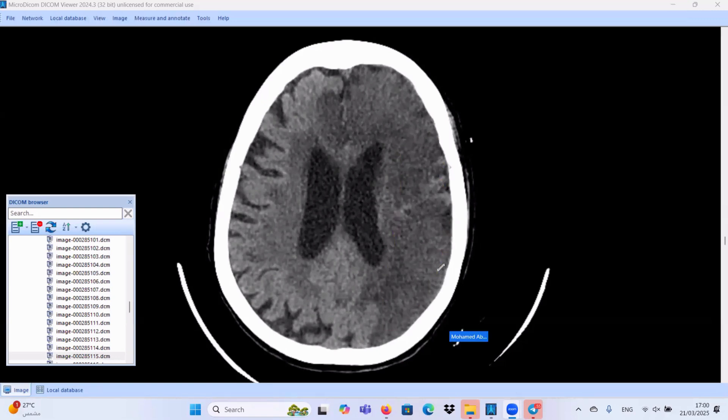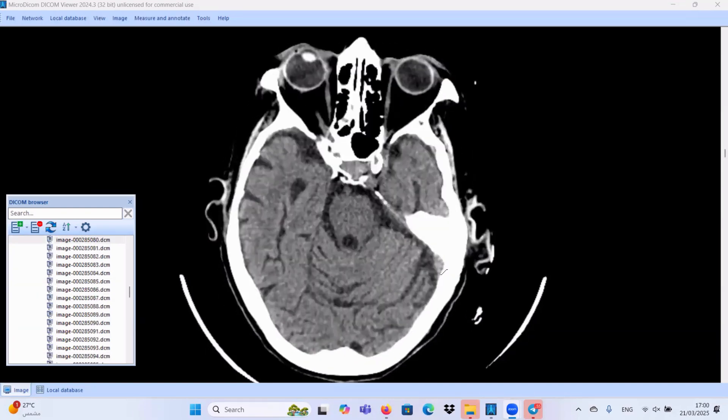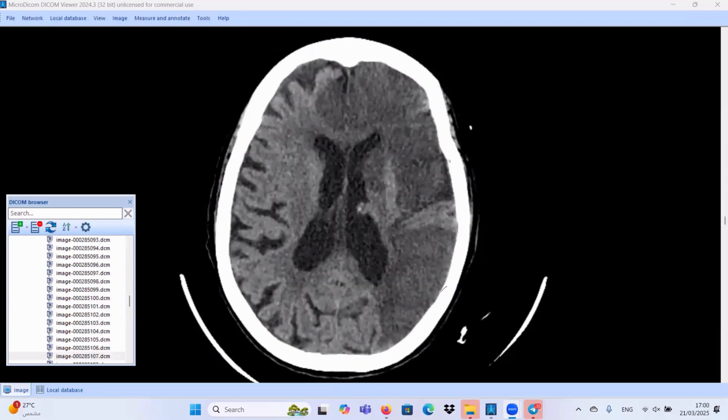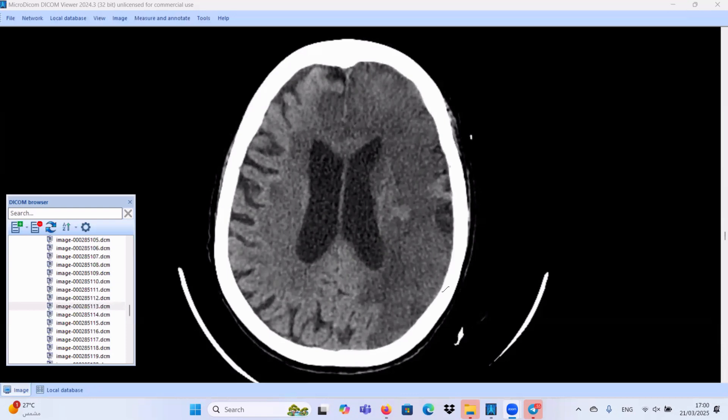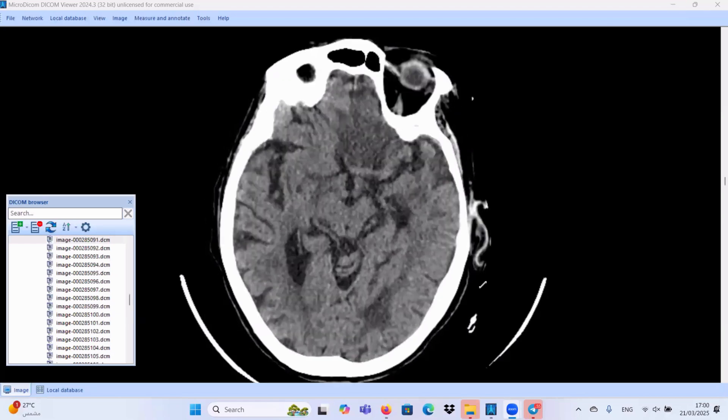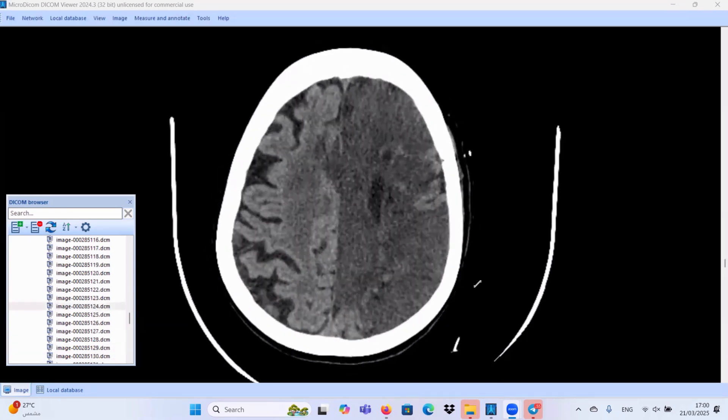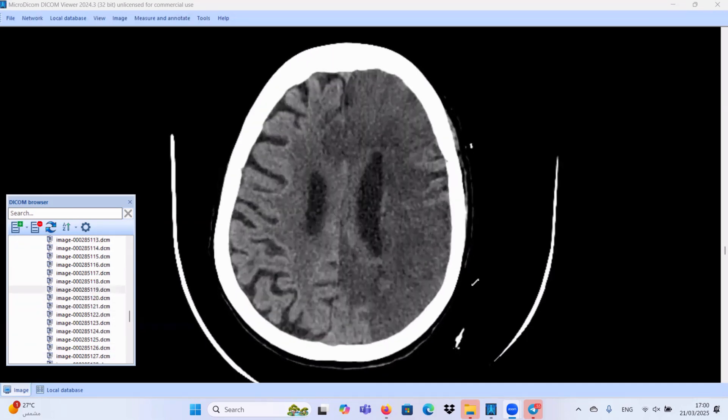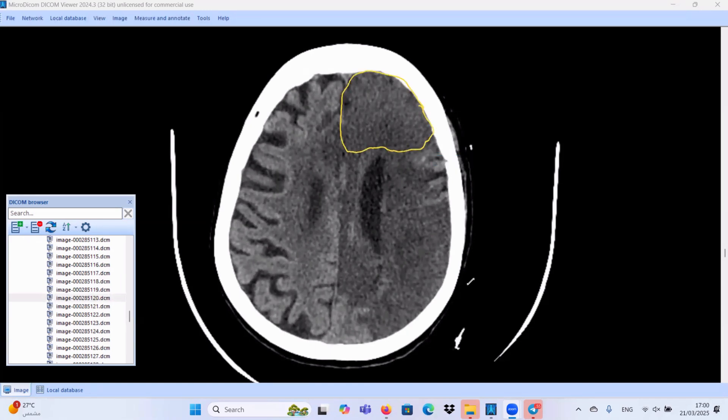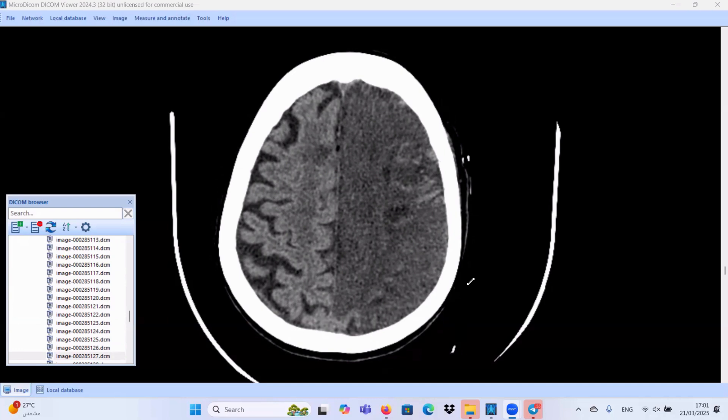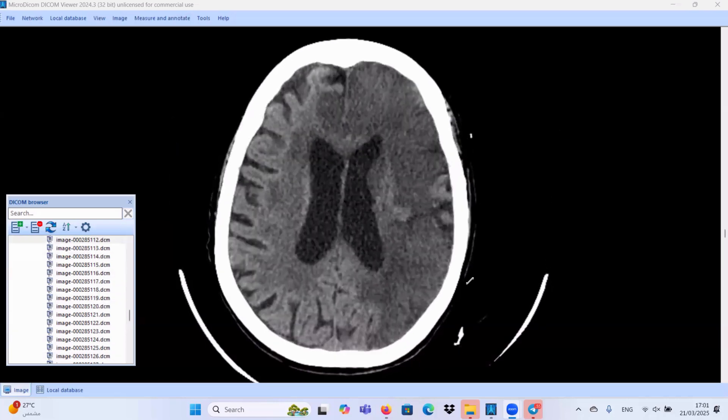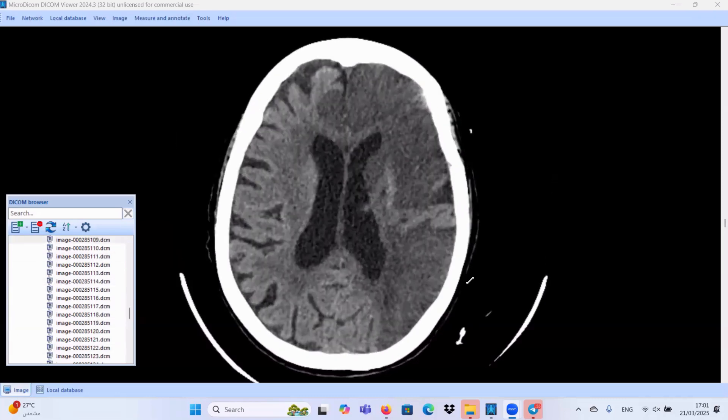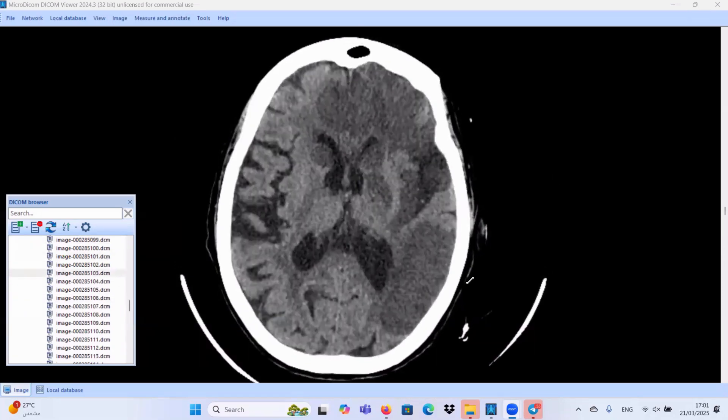Those areas represent an acute infarction along the left middle cerebral artery territory. And this infarction is acute because we have effacement of the cortical sulci. We have loss of the gray-white matter interface. So, for sure, we have a form of cytotoxic brain edema and it's acute cytotoxic brain edema. Also, we have another territory. Let us see the frontal lobe. It is totally effaced and there is a large hypodense area at the left frontal lobe. Also, the frontal hypodense area is extending posteriorly along the left paramedian portion along the left frontal parietal region, parafalcine location. This is a territory of left anterior cerebral artery. So, we have combined infarction along left anterior cerebral artery and middle cerebral artery.